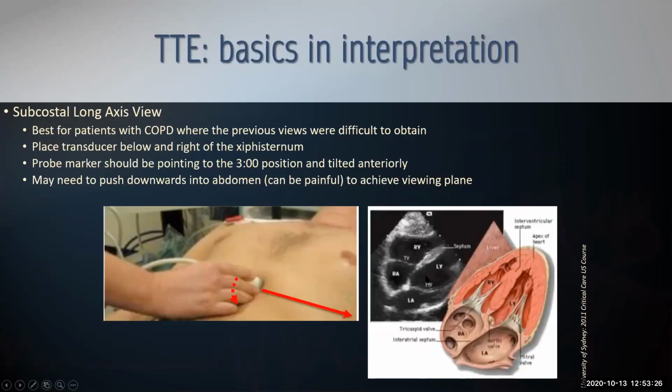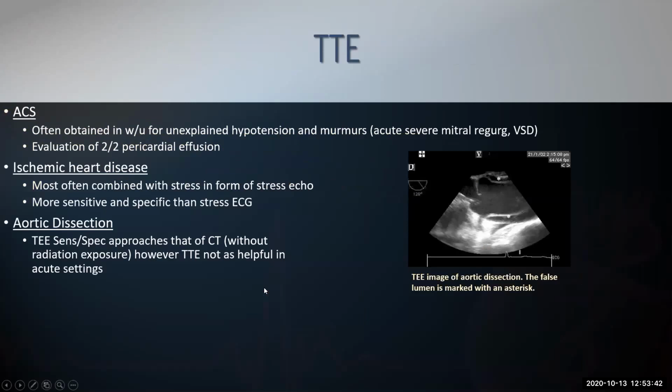You can see the left ventricle, the mitral valve, and then the right atrium. So the mitral valve's here, the left atrium into left ventricle, right ventricle from the right atrium with a tricuspid valve. So you can also get a four-chamber view if you're able to get a good one, in the right patient, in the right body habitus. And as Dr. Duffy mentioned, this patient they had on Team A, since they were thin, it was a good option for them.